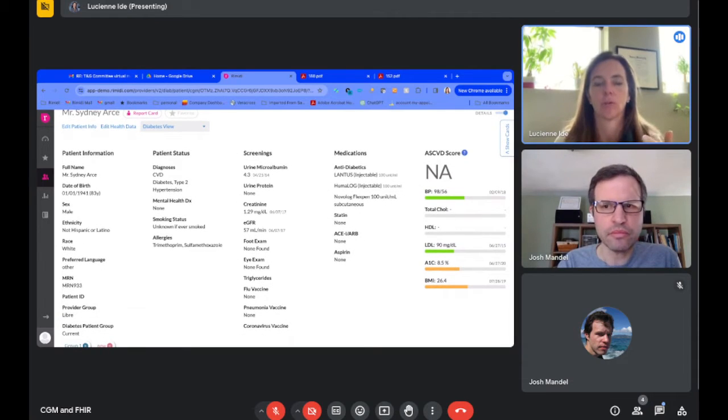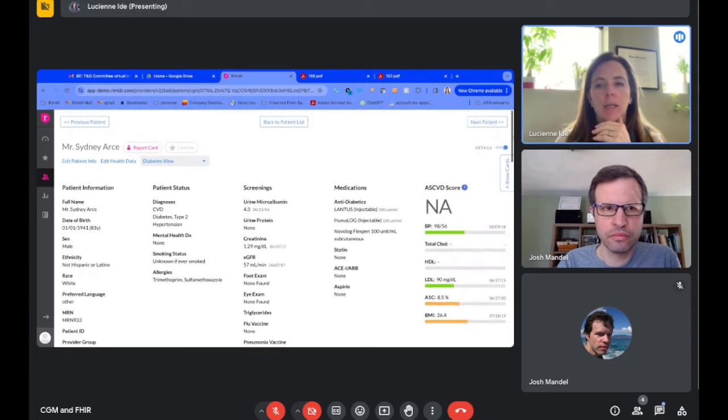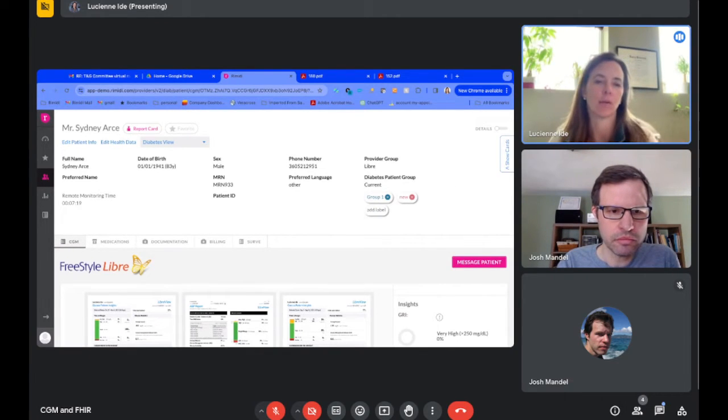So that's our approach, and that's what we do with all device data, right? Whether it's CGM or connected glucometer, connected blood pressure cuff, right? Is to help with that physician interpretation, and then to help drive our clinical decision support around it. But that's level 1 of the experiencing of CGM data: we are making this available in the chart so that the provider is not having to go out to a third-party portal that doesn't have single sign-on and doesn't have a data interface.